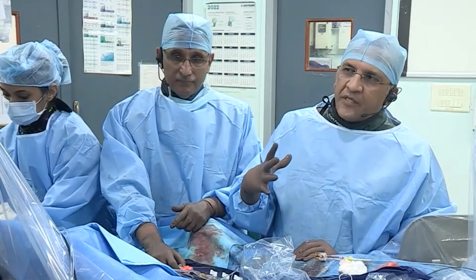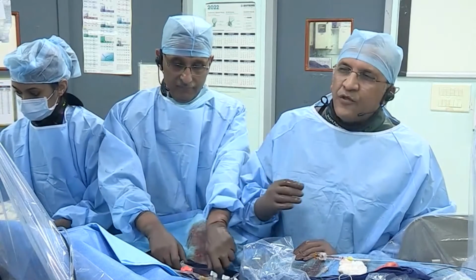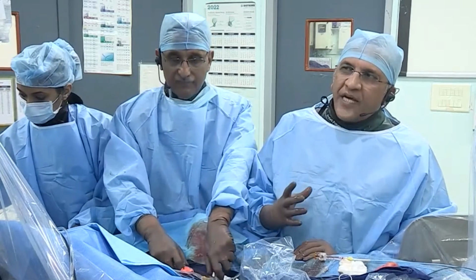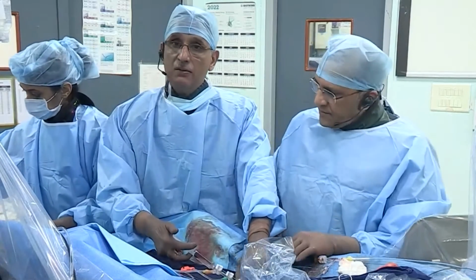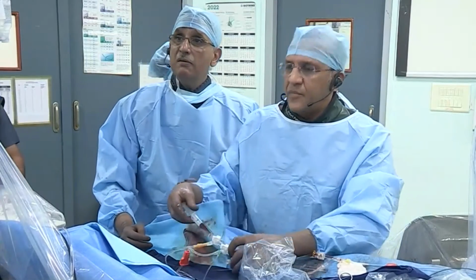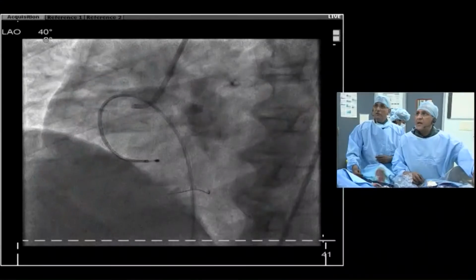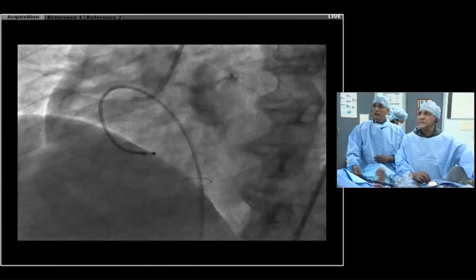So sometimes it's okay for me to just put in a pacing wire, even if I think it may not be necessary, to make my life easy and not have an event which prompts me to do it. I agree. There are also ways you can rig a pacing setup to the rotawire itself, so you can pace over the rotawire if you need to. But for now, this is a reasonable way of doing it as a whole.